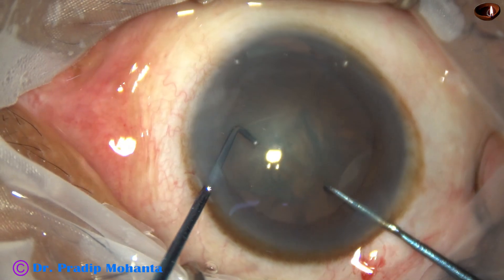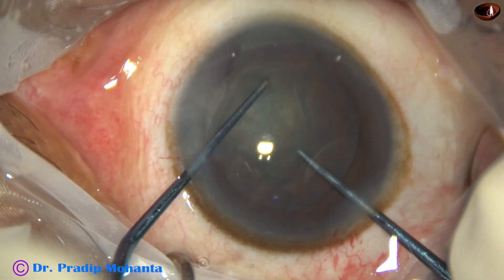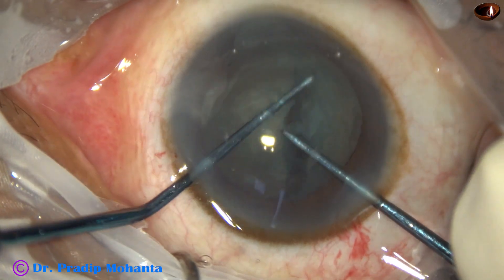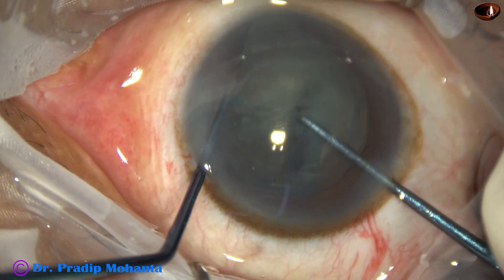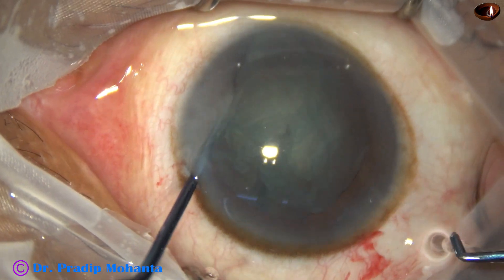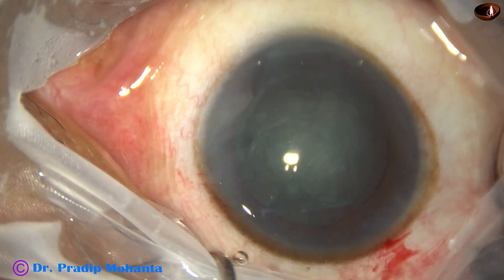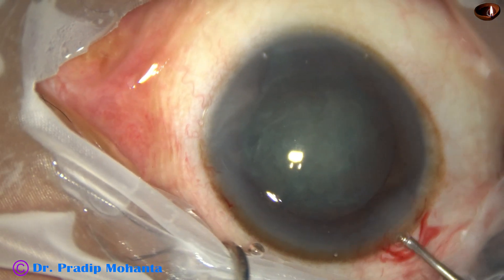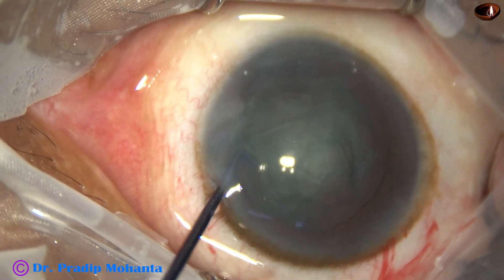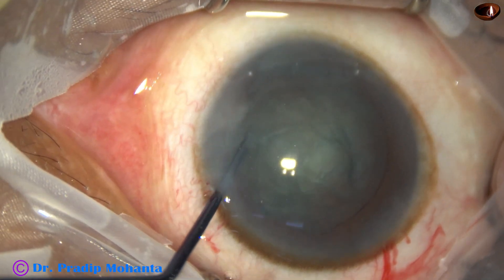Now I am using Mohanta's pre-chopper to divide the nucleus into some pieces. This creates two hemi-nuclei; rotate and then divide one hemi-nucleus into two parts. I come out and can inject visco and divide the other hemi-nucleus, but that is not necessary.